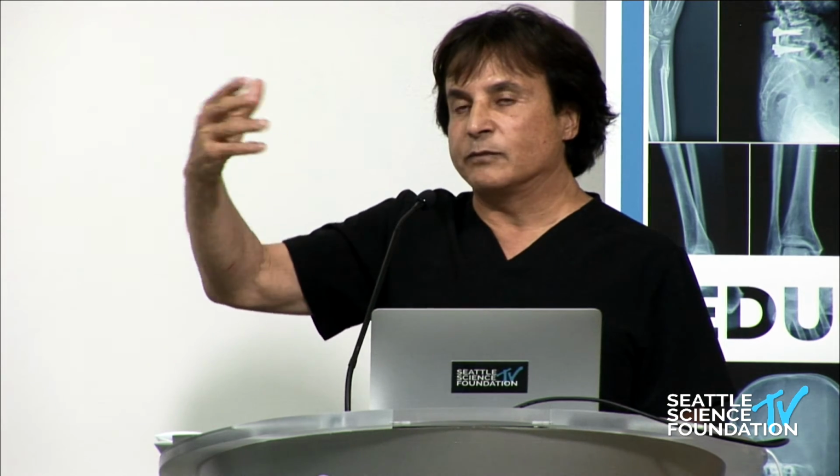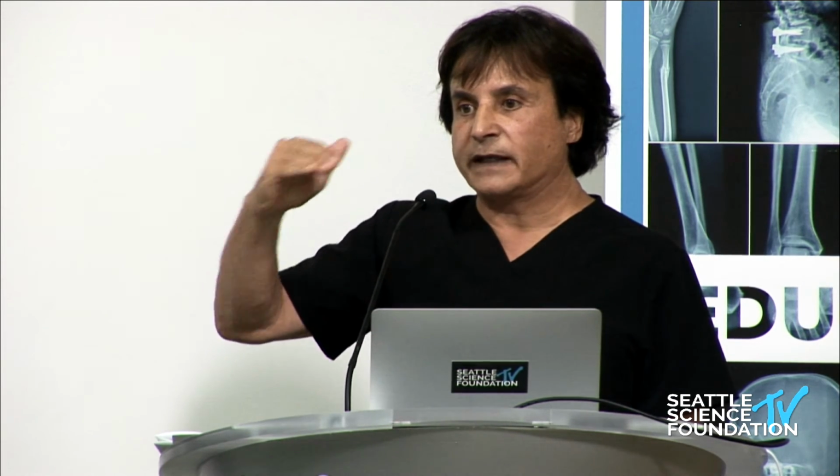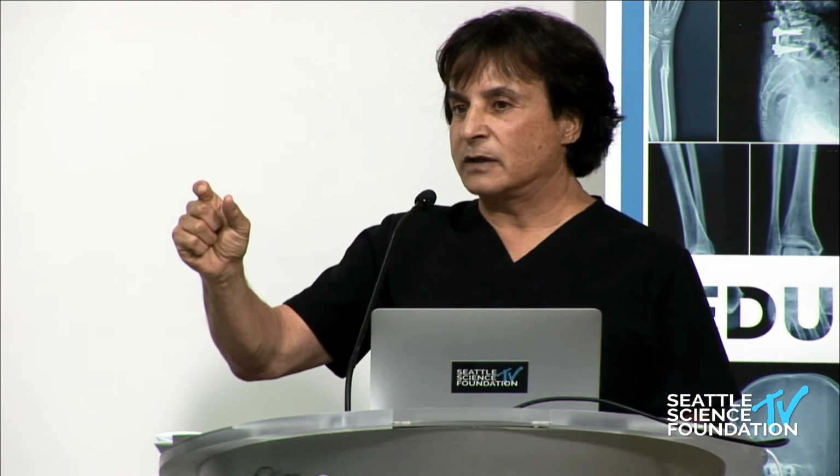I think putting them supine on the table, you'll get some reduction. Furthermore, to visualize the disc, I will take down the inferior aspect of the vertebral body. That way I can see the disc space. And then what John Cosworth taught us is to do a fibular strut from the front as opposed to from the back. So that's what I would do, because you're not left with much disc space to deal with. So really, to try and put an intervertebral device, that's going to be super hard.